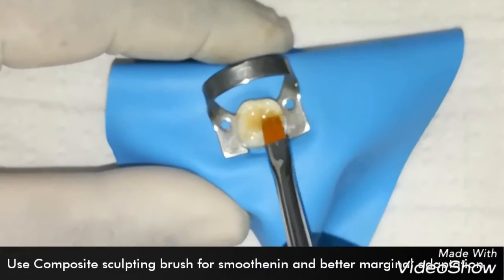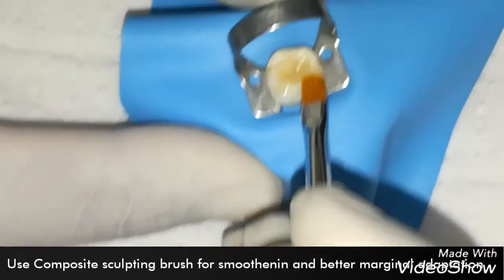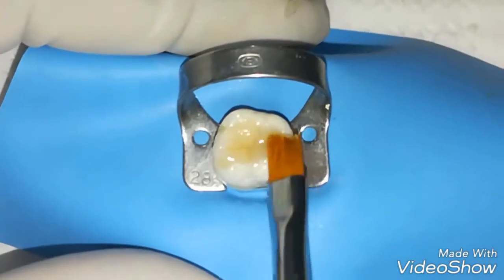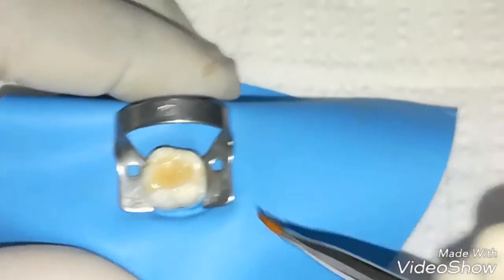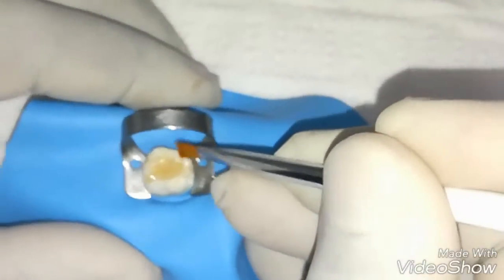Now we are going to use a brush from the center to the cusp to give it a smooth and nicer glazing effect, cusp by cusp.